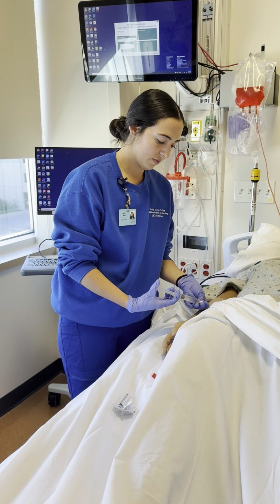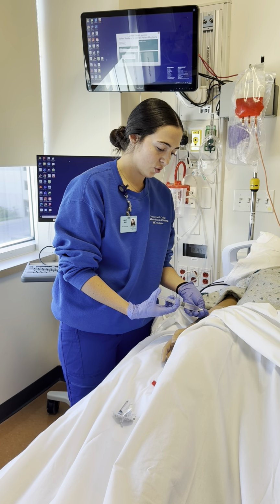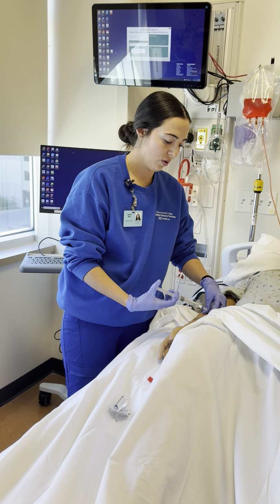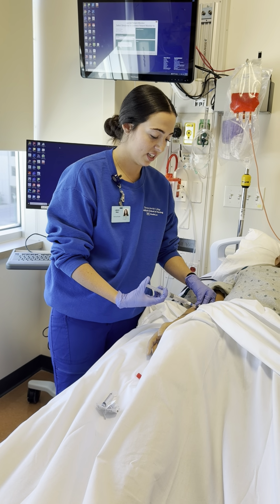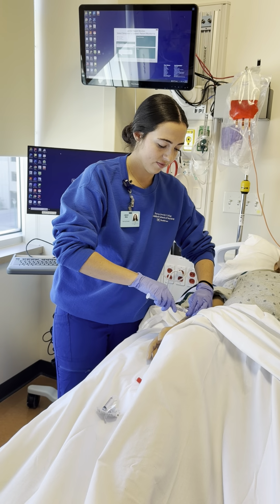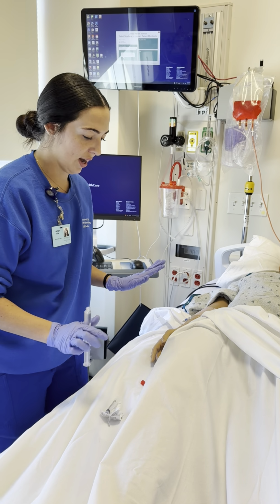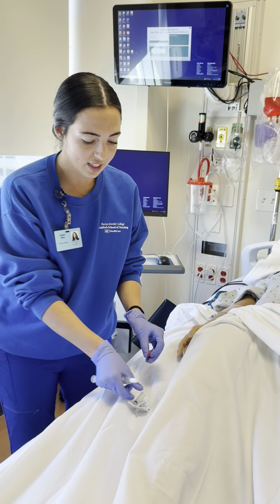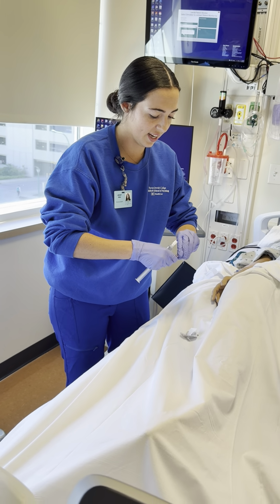Nice and slow. So after I've made sure that all the medication has been pushed through, I'm now going to make sure that I lock it into positive pressure. Alright, it's all completed, so now I am done administering the medication. I'm going to lock up this here. I'm going to grab all my supplies.